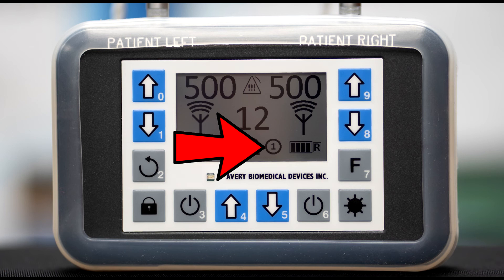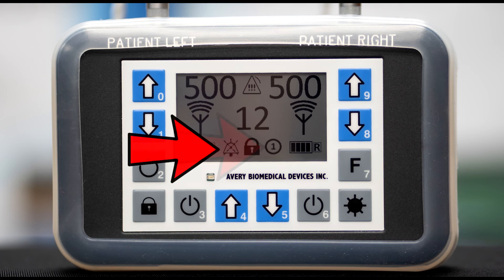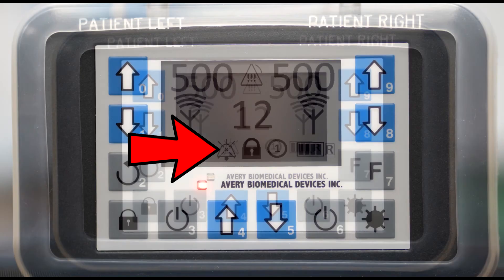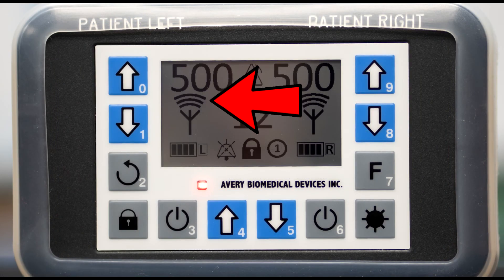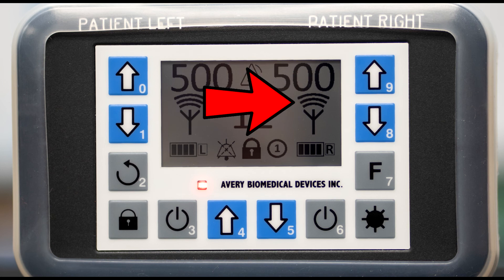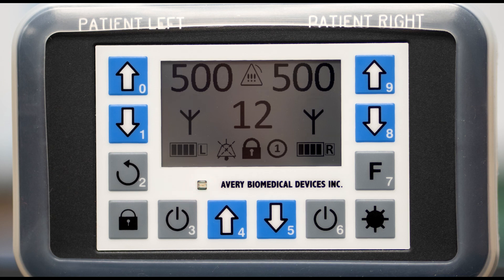Parameter mode icon — Mode 1 is factory standard. And the mute icon showing that the alarm is temporarily muted. During the inspiratory period, three curved lines above the left and right antenna icons will appear, signifying that the antennas are transmitting a signal. During the expiratory period, the three lines are no longer present above the antenna icons.